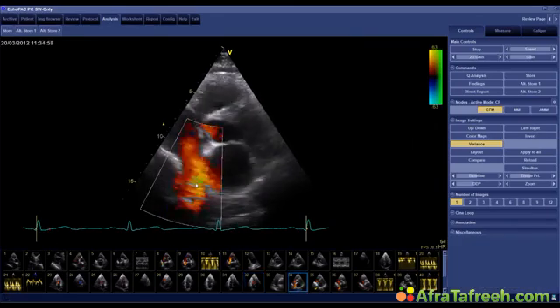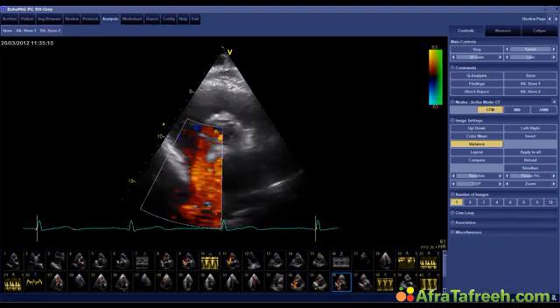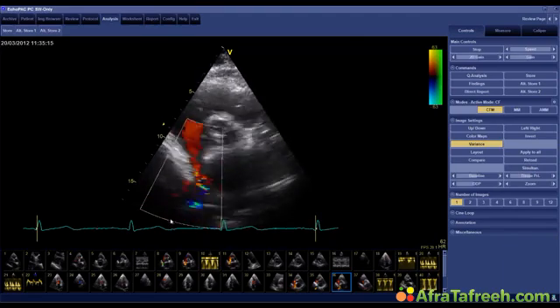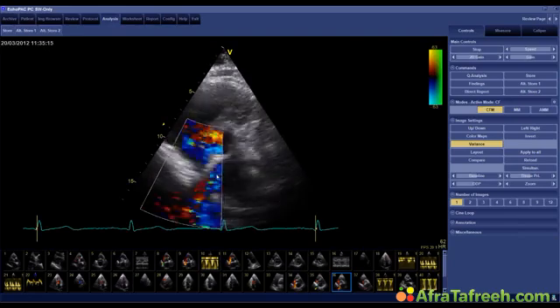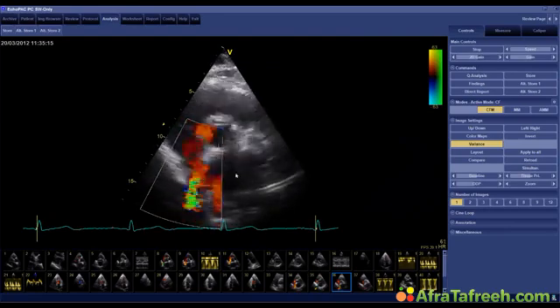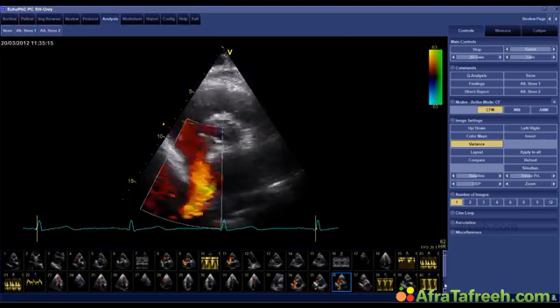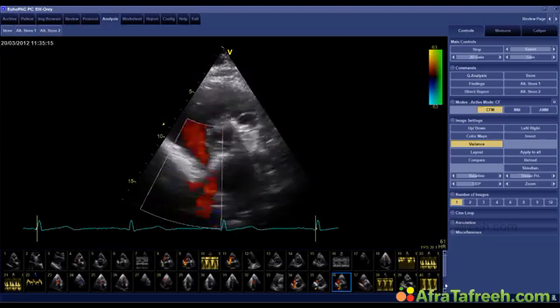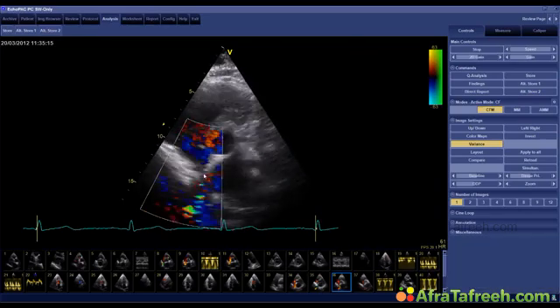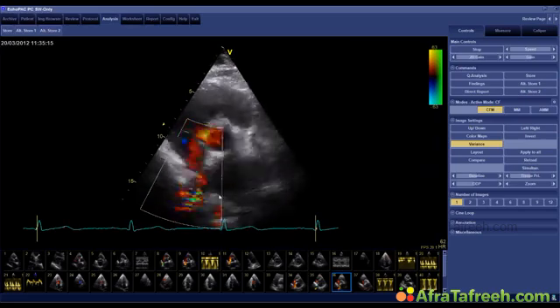It's simply the inflow from the inferior vena cava. You can nicely see this here in a short axis view, where you can see the inflow of the inferior vena cava, and the flow goes towards the interatrial septum, and then it kind of bounces into the right atrium, but there is no flow directly from the left atrium to the right atrium. There are a lot of things which speak against an atrial septal defect.